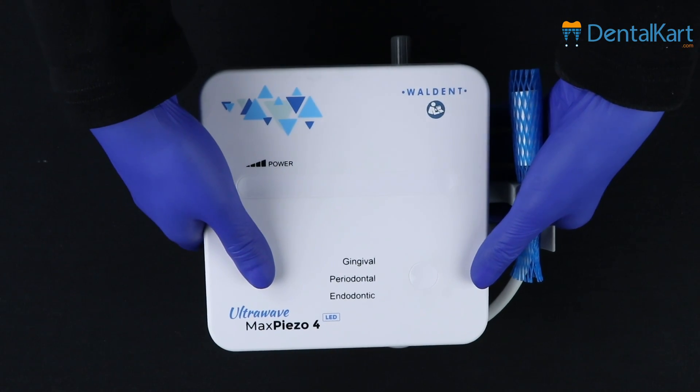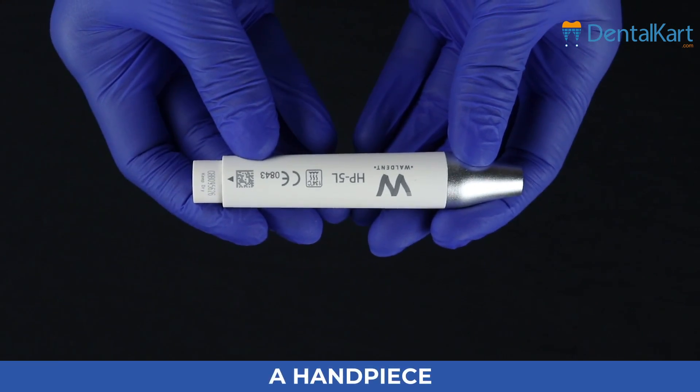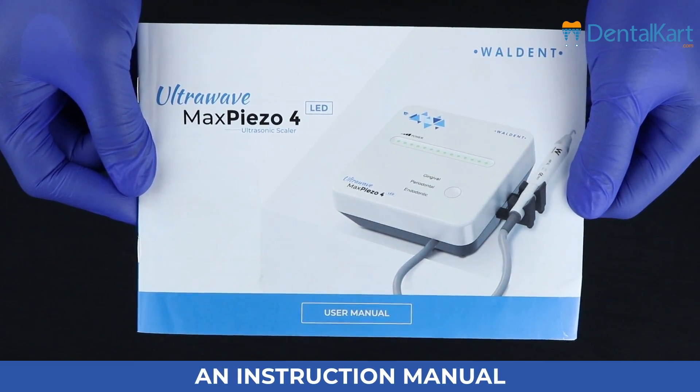The product is mainly composed of a function control circuit, an irrigation system, a tip set, a handpiece, a torque wrench, an endotip wrench, a foot switch, and an instruction manual.